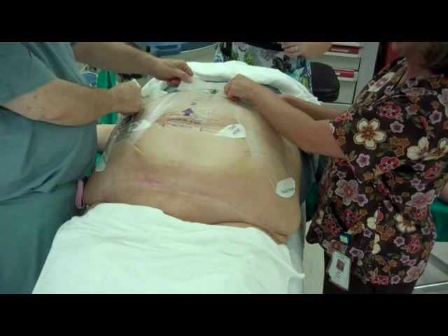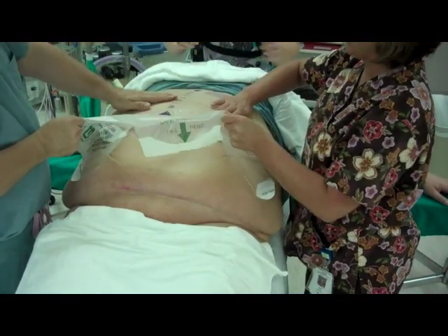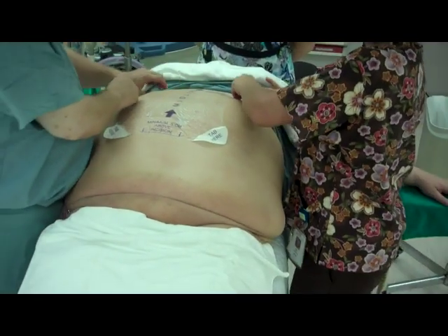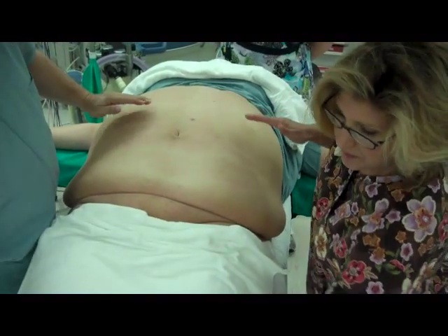Again, to remove the device, grasp any exposed tab and slowly peel the film from the patient while supporting the skin in the process. As this is a single-use-only device, please discard appropriately.